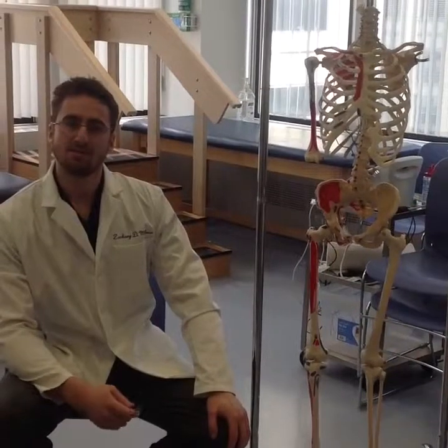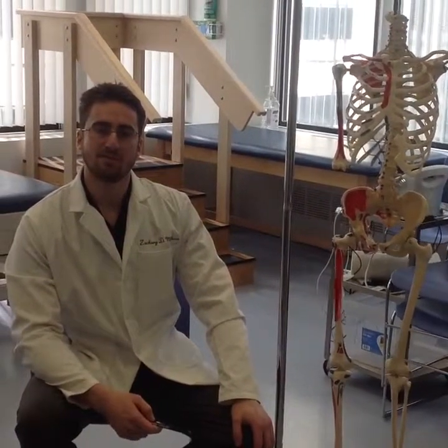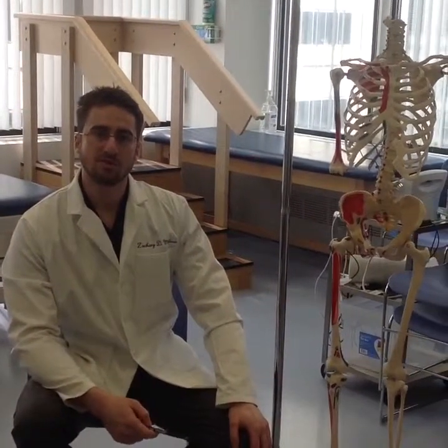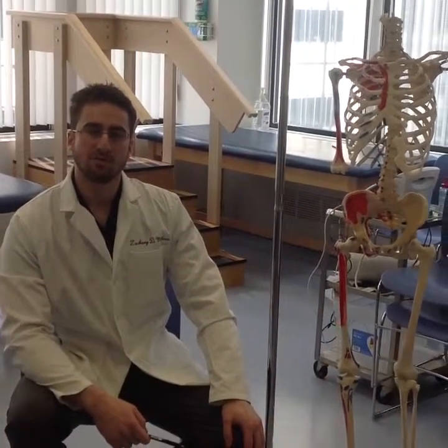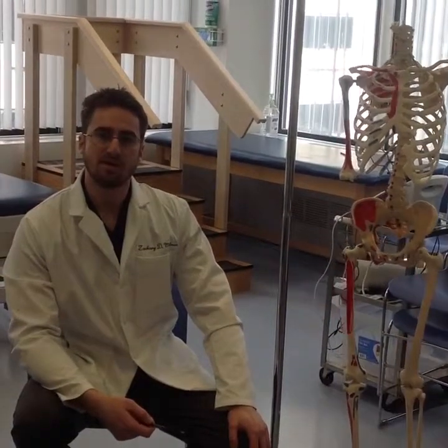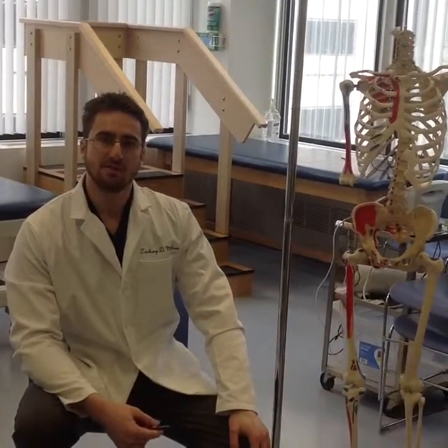Greetings everybody. Today we're going to be talking about hip abduction range of motion using a goniometer. It's a very important test for anyone who has hip pain, issues with walking, or general lower body dysfunction.